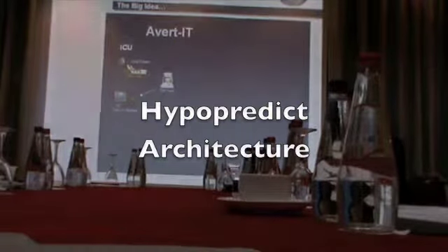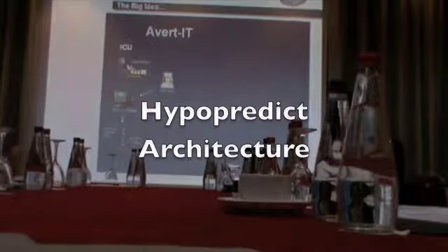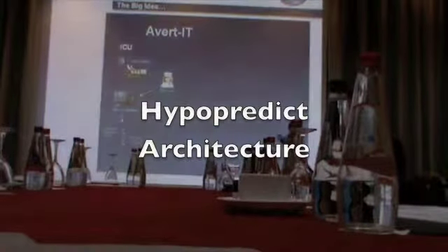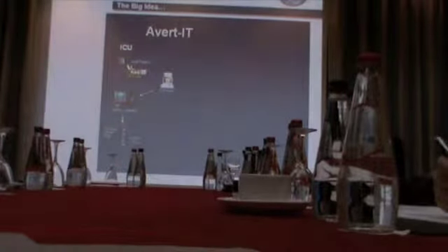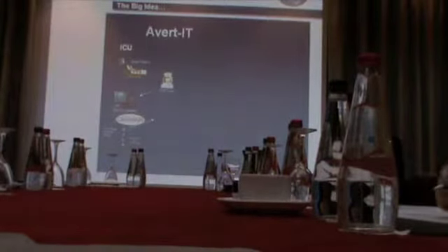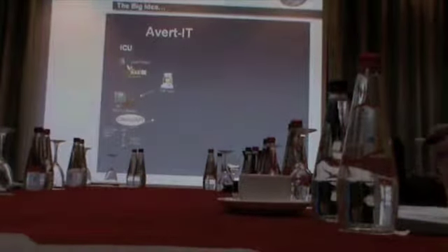Staff nurse adds them to the local patient monitoring system, and that system starts pushing out data on a regular basis. Here we've got a 10-minute interval immediately. The first part of the HypoNet program is called Clinical API, and that interprets the demographic data from every patient that comes into the ICU.